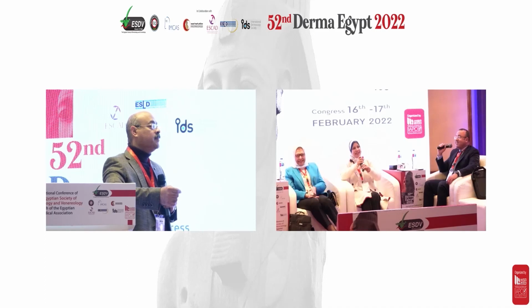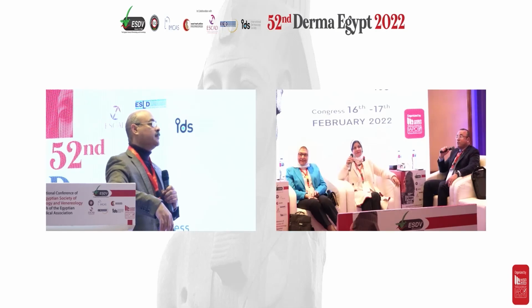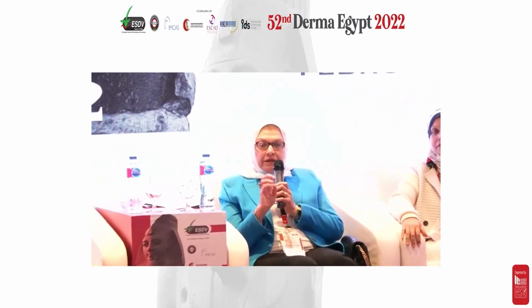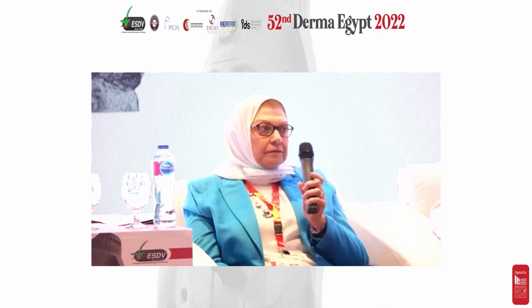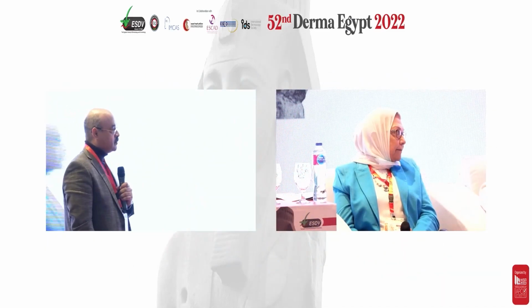No, yes, you're right. It's a sign of aging, so it will recur. For me, I prefer in dark skin using the erbium, fractional erbium. So fractional laser to stimulate the collagen. Ahmed? I assess the patient first because sometimes it's due to hyperseborrhea, others are due to photoaging.